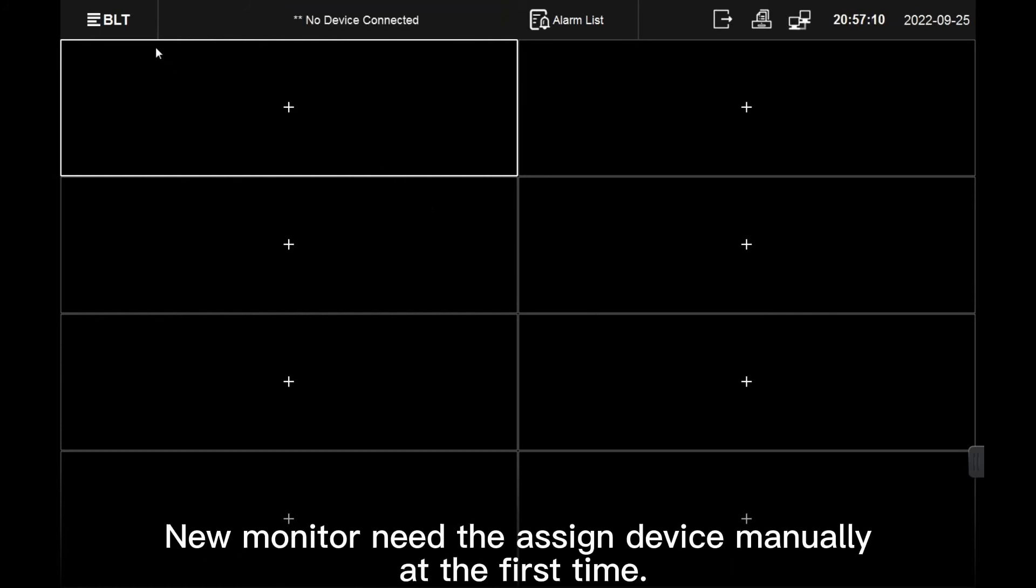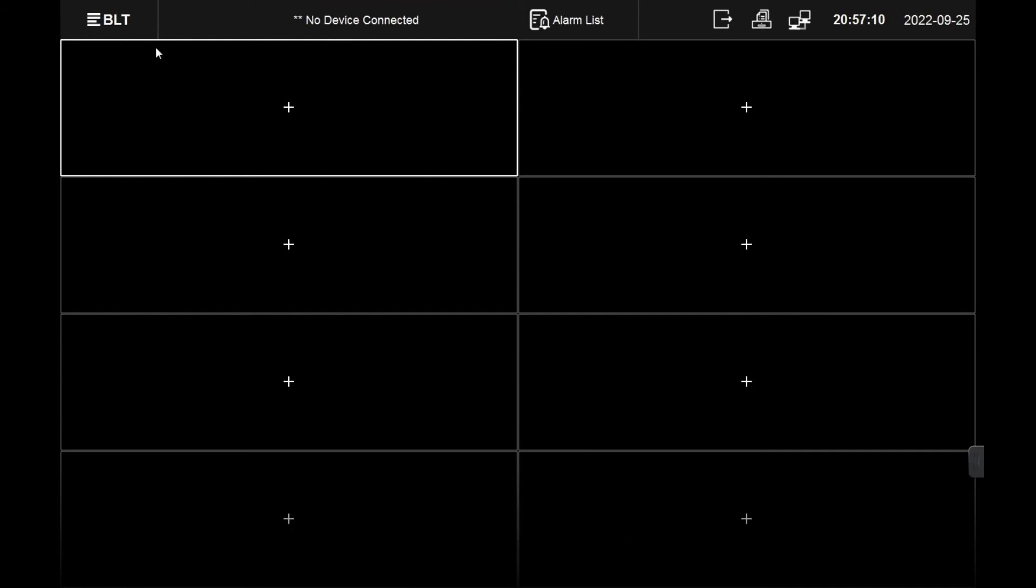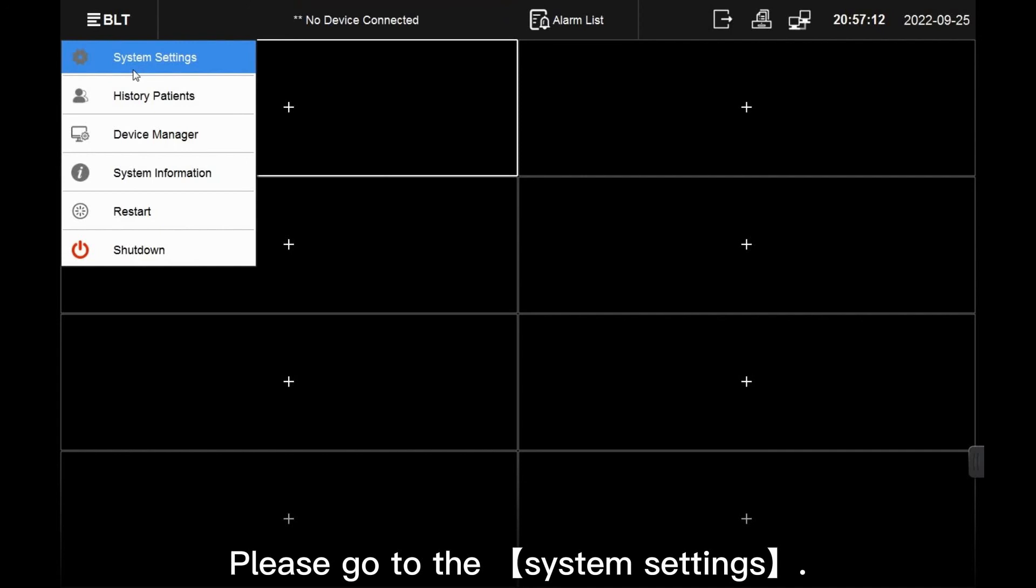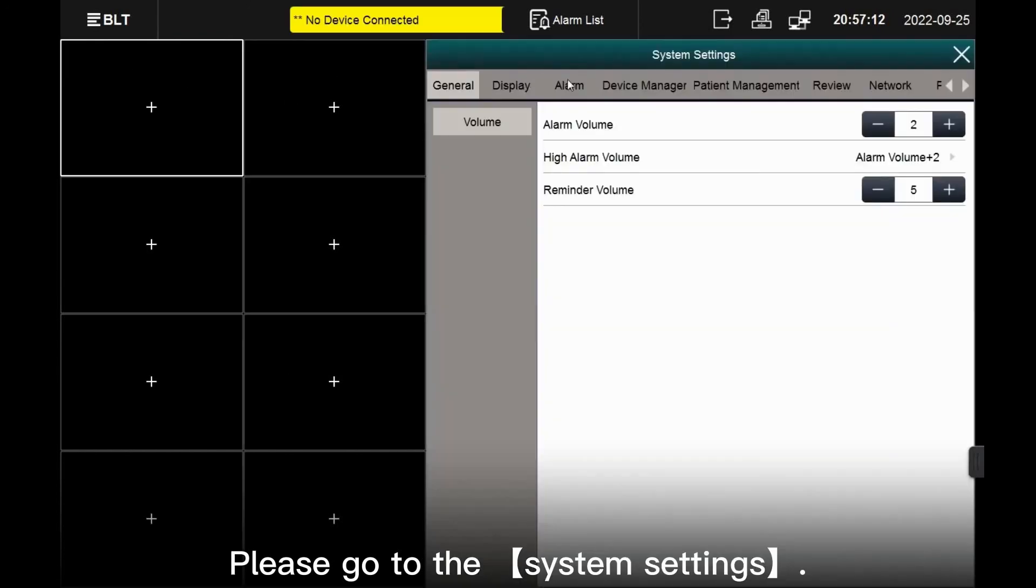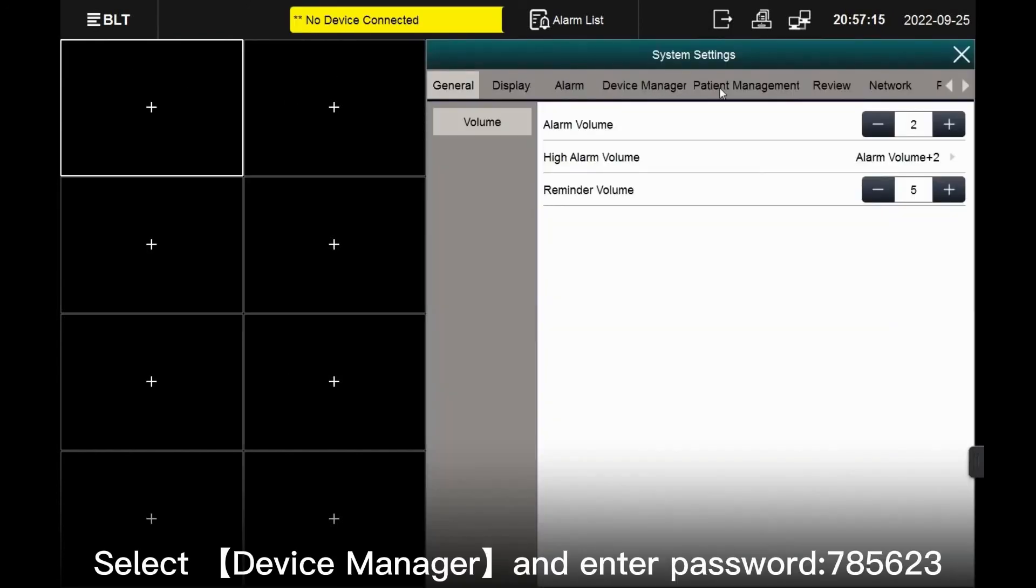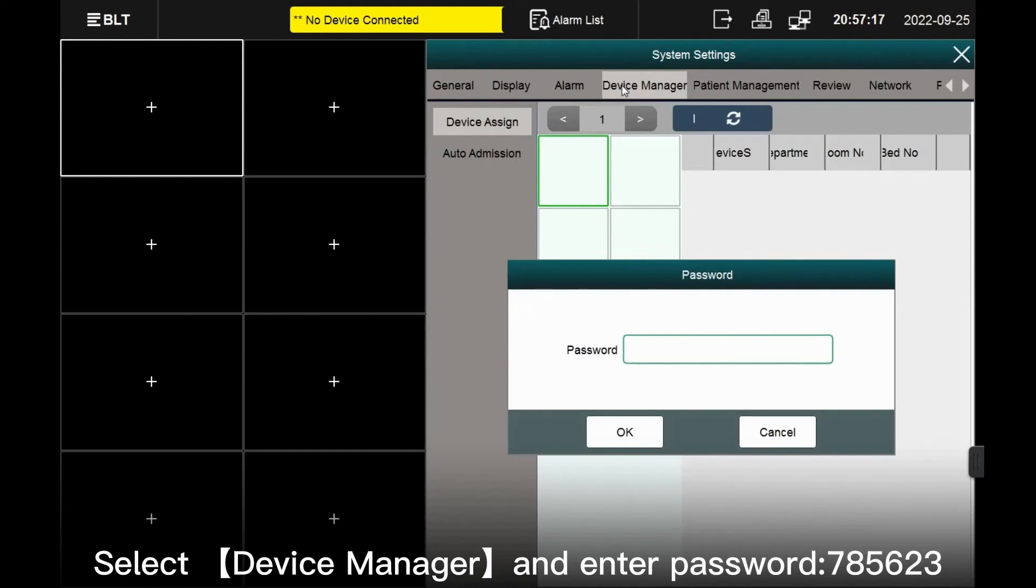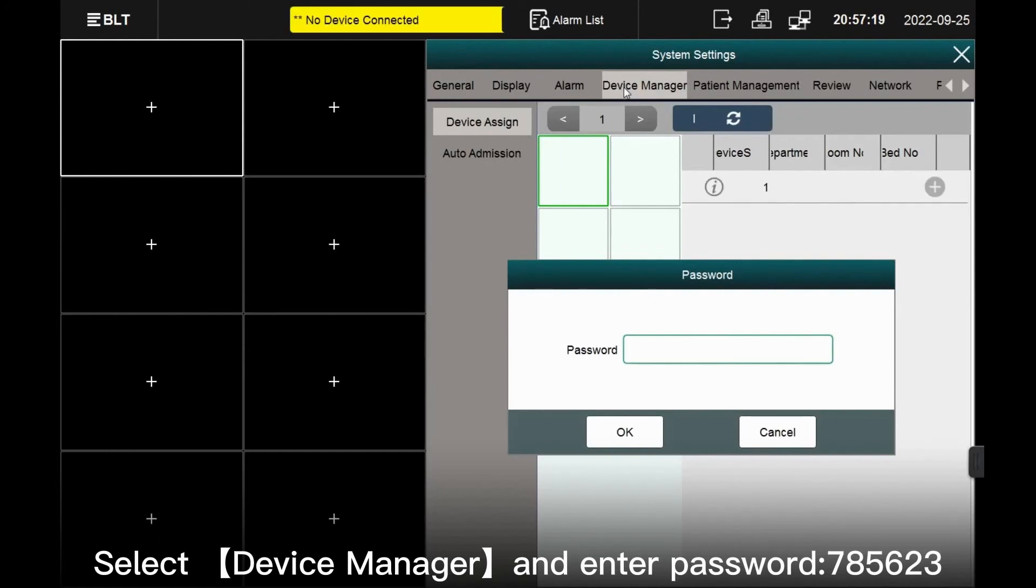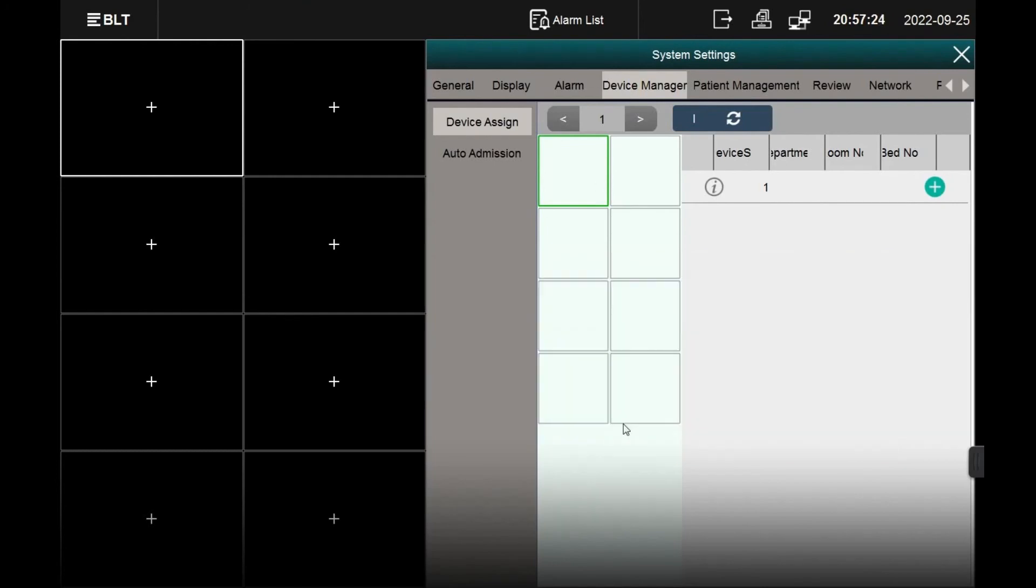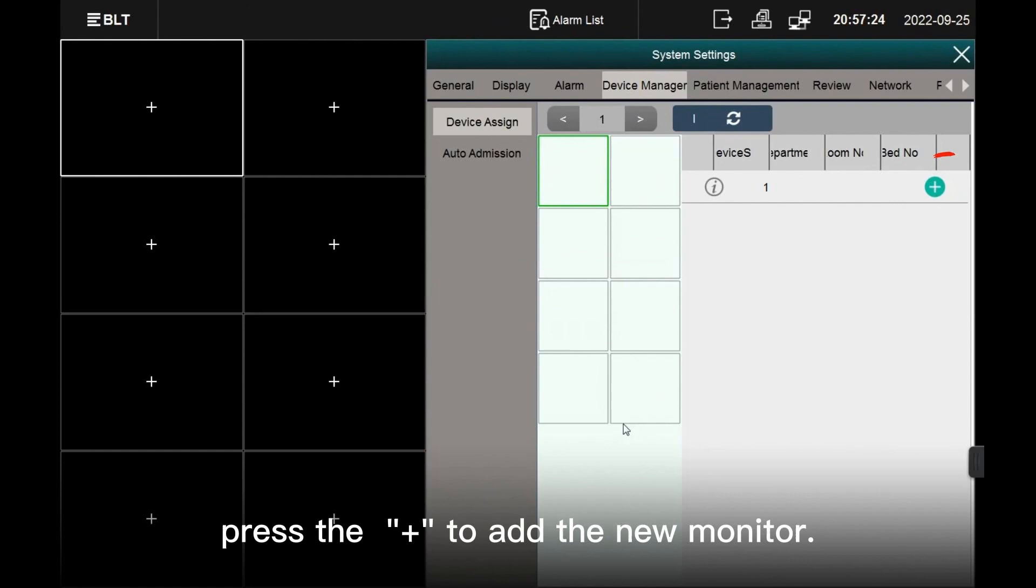New monitor needs the assigned device manually at the first time. Please go to the System Settings. Select Device Manager and enter password 785623.